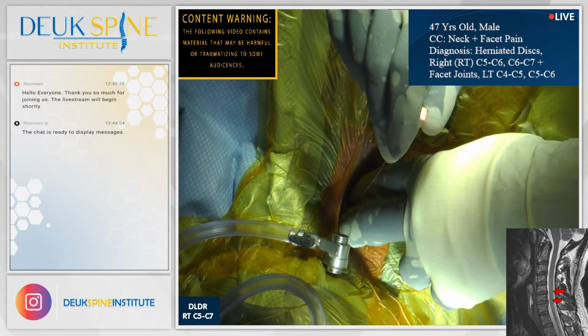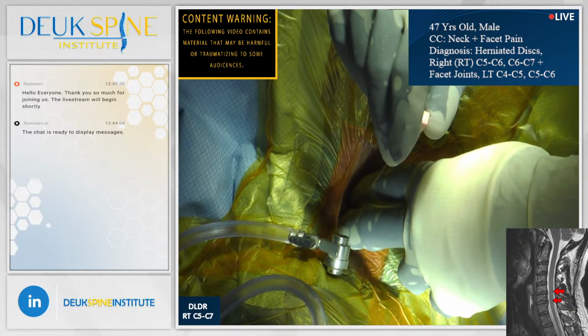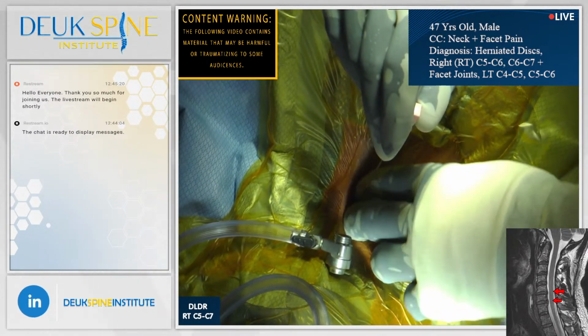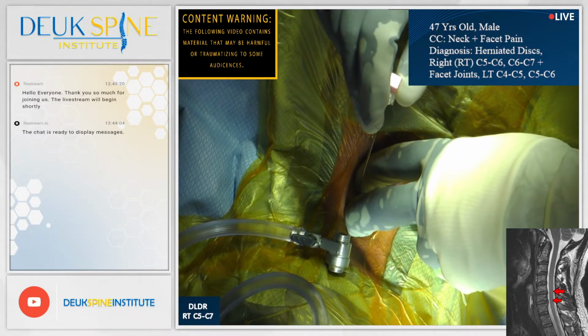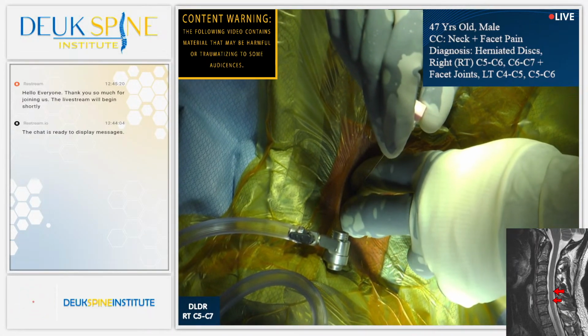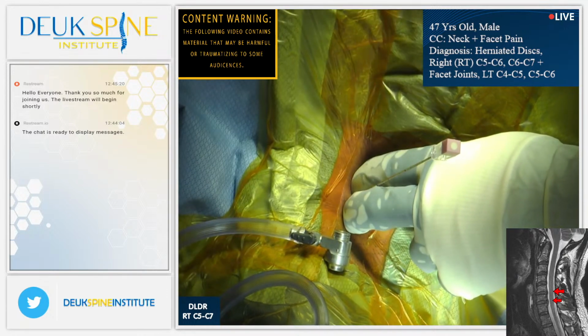2, 3, 4, 5, 6. You agree we're right at 5, 6? Yeah. I think I might start at 6, 7. Shot. I'm going to come down a little bit. Go ahead and give me an AP view. Let's see where we are.